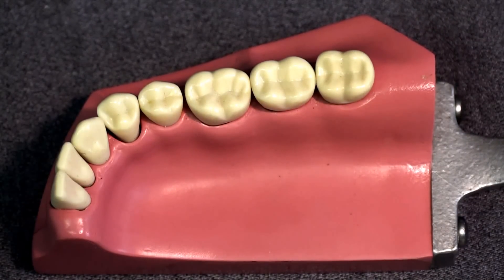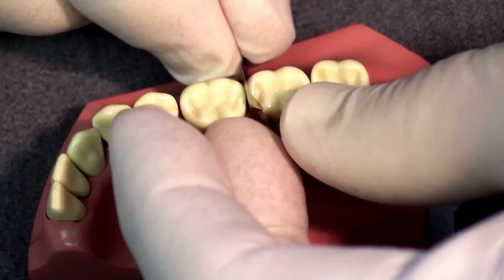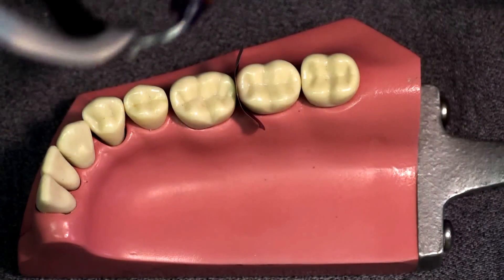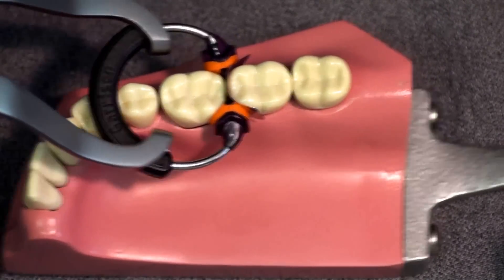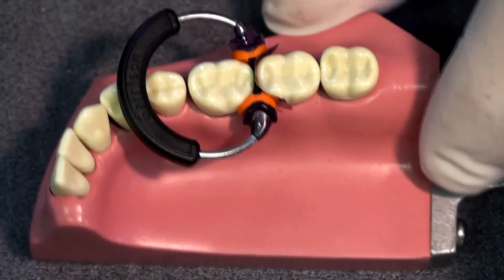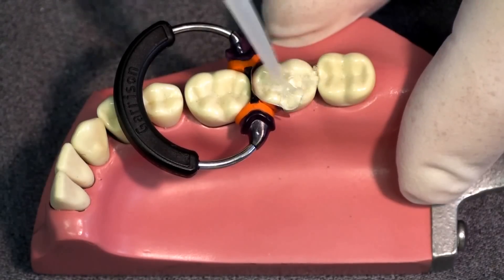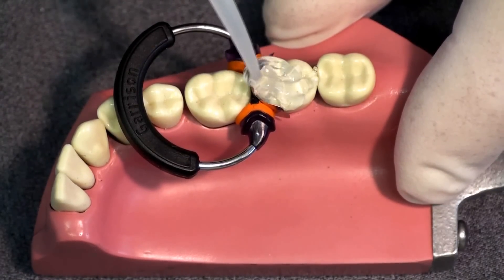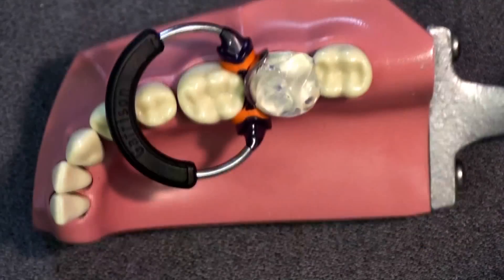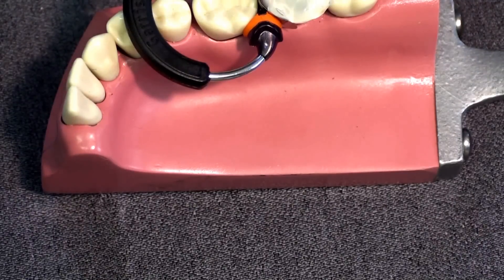In this demonstration we have just anesthetized a patient. While we're waiting for anesthesia, we'll place a sectional matrix between the teeth that we're going to be working on. In this case, number 31, we're going to place a clamp on the tooth. We're now going to take an impression of the occlusal surface of this tooth prior to operating on it with a clear bite registration material. This goes very quickly — I trace the grooves of the tooth and get the embrasure between the band and the tooth.